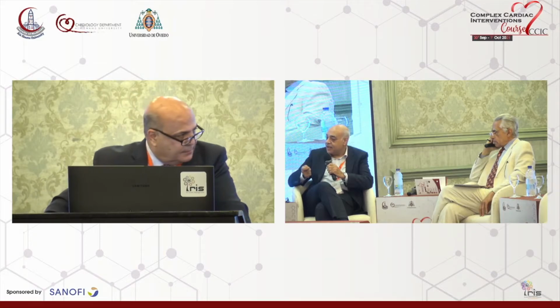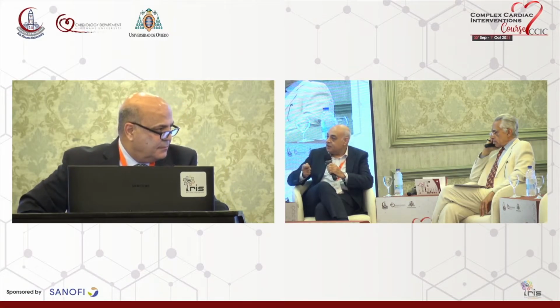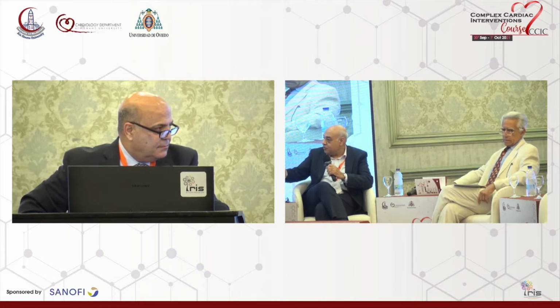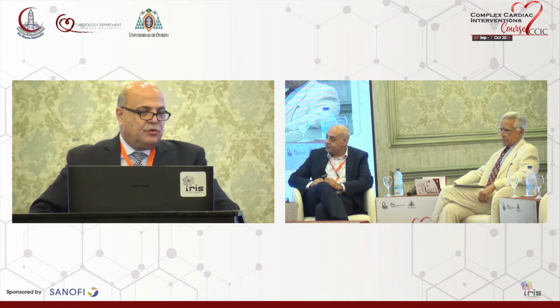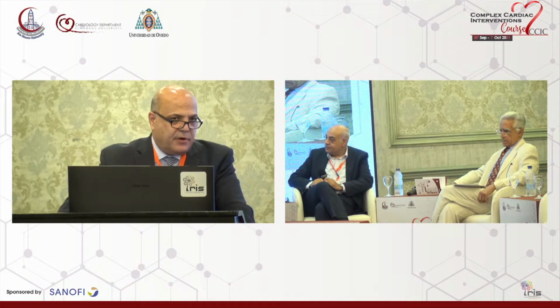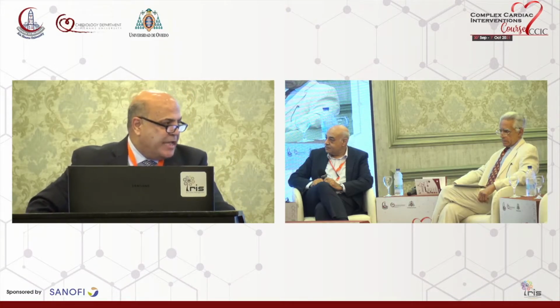what is its value? Angiographically, I would treat the proximal circumflex without going to the iFR. The iFR result was 0.94 for this site of lesion. It's hemodynamically very insignificant. The role of iFR depends on the extent of its value. Yes, based on the randomized controlled trials, FFR or iFR is recommended in lesions up to 80% stenosis.